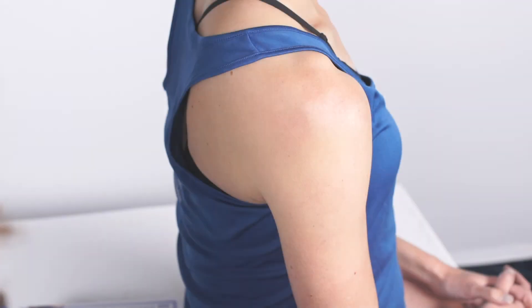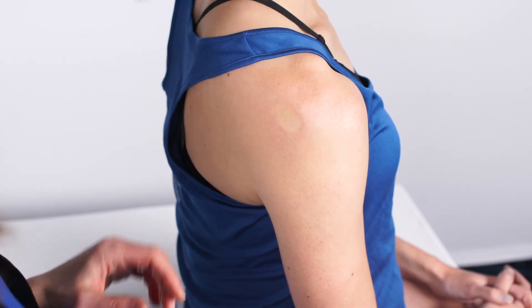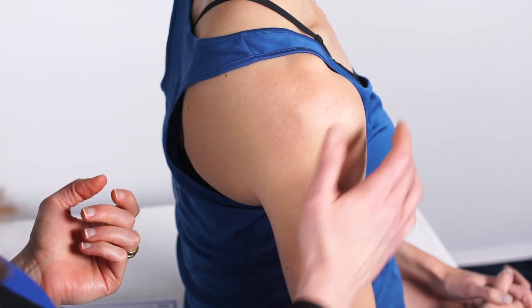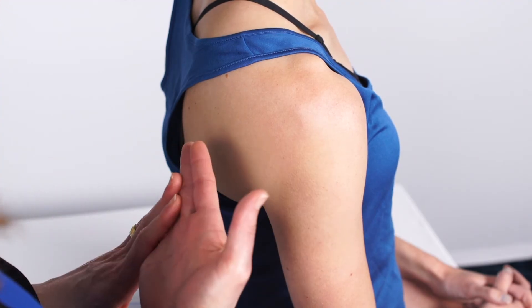For the next step I'm going to show the landmarks for the injection and how to prepare the skin. For the subacromial shoulder injection you could take one of three approaches: the anterior approach, the lateral approach, or the posterior approach. I like to use the posterior approach because that's the way I was trained.